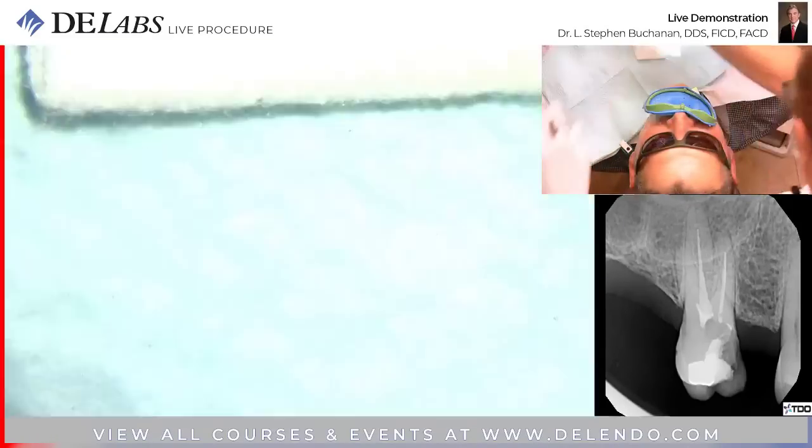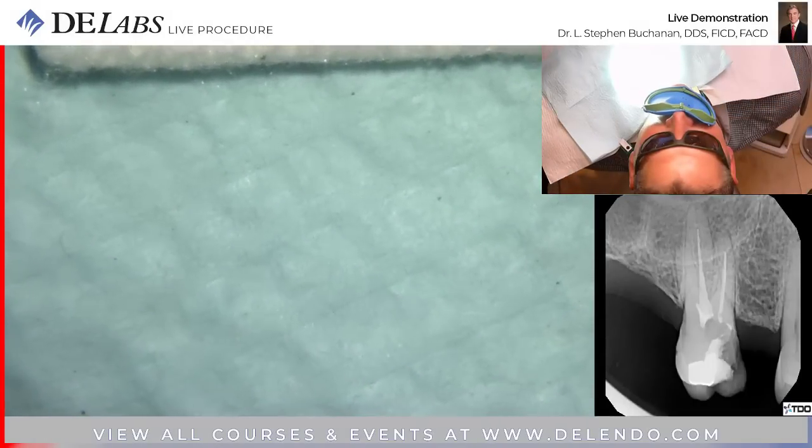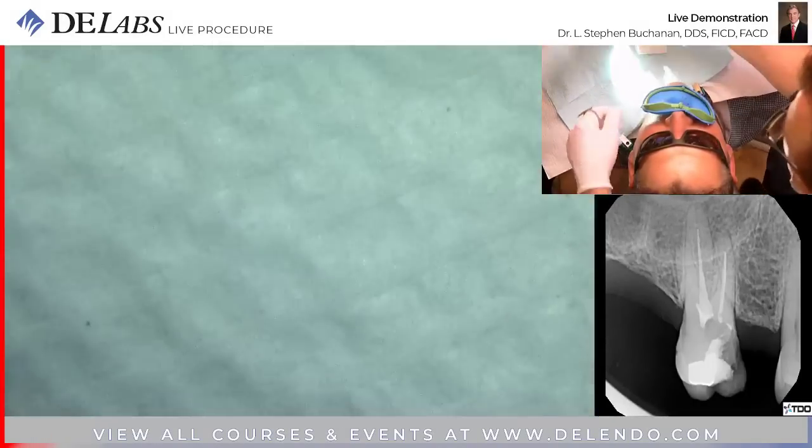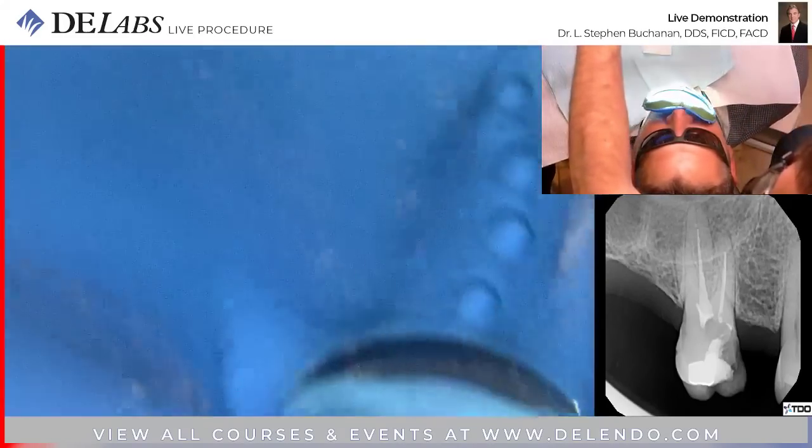Okay, we're about ready to do the cleaning portion of the root canal. It's going to take 8 minutes. I'll get bored, but it's just the same as all the rest of this procedure to you. You should have no discomfort whatsoever.